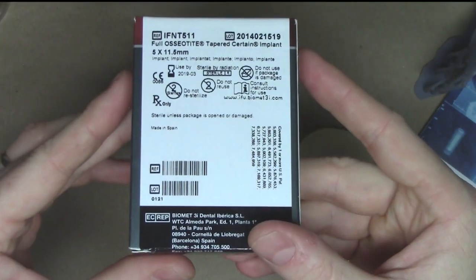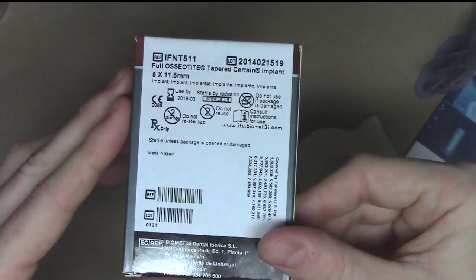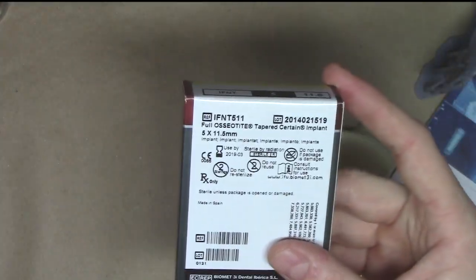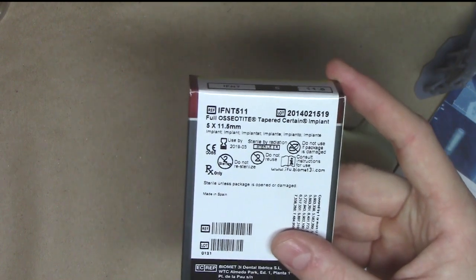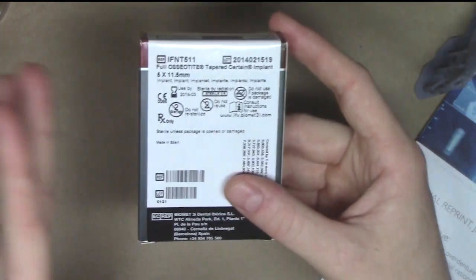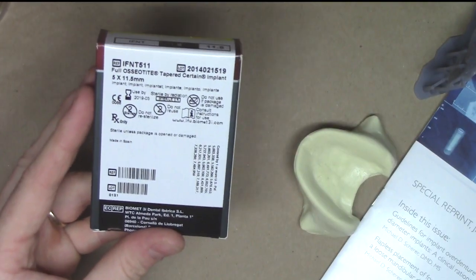Also within our implant boxes, we know that it's very similar to what you would see with the Zest locator overdenture system. This particular implant, however, only includes the cover screw. So if you wanted your analog, your abutments, or any of the impression posts or the parts that are needed for the complete denture, you will have to order those separately through your implant companies.